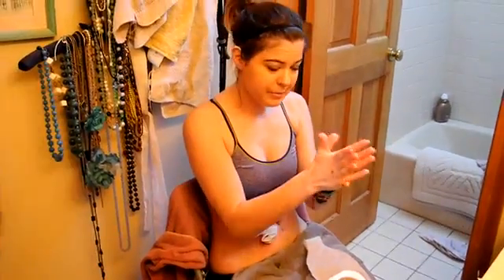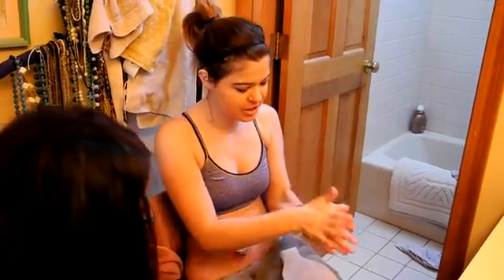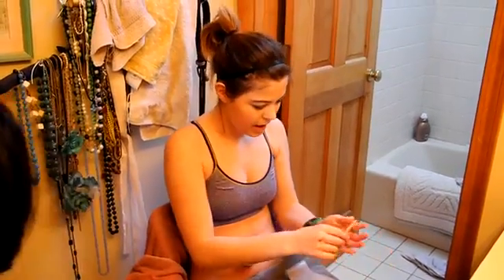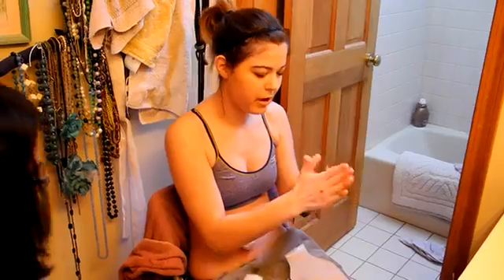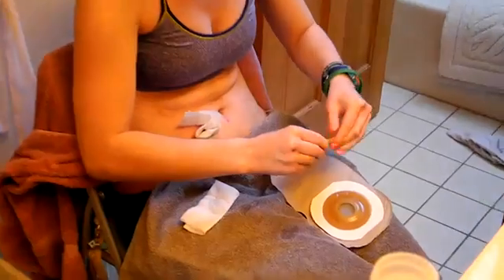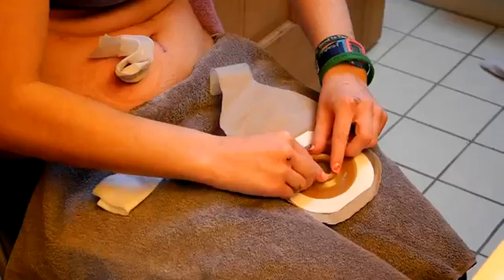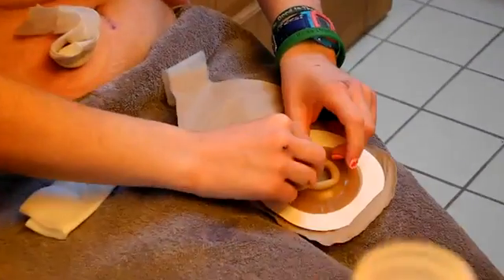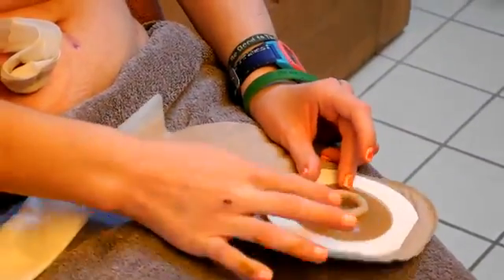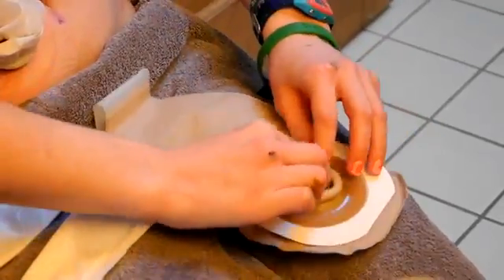When you take your barrier ring, you want to warm it up in between your hands, and it's very pliable, very forgiving material. It's really great. So I was told to roll it like a snake or a worm, and okay, it needs to be a little bit longer, and just kind of stretch it a little bit, and just put it around the hole that you cut out. That seems pretty good. Then you can pat it down if you want. I really like this a lot better than the paste because the paste is not as forgiving as this ring is.